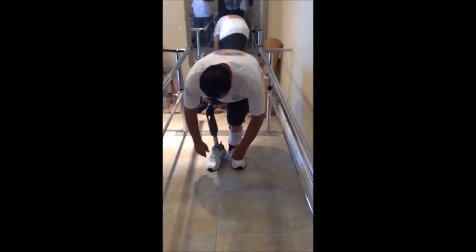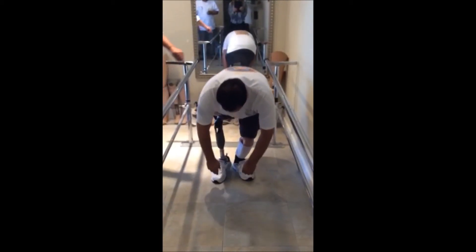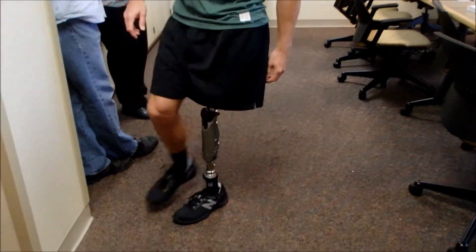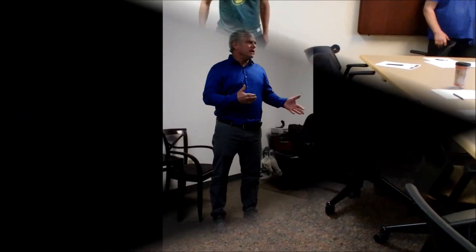Now there's no power to lift them up — that's all about the sound side and using their hip — but they can do range of motion they've never been able to do before. All of that translates into those periodic things: it's the bathroom, it's the kitchen where people fall most often. So they're able to push backwards in a bathroom or kitchen and make strange motions, and those motions are where they fall. I like to train them with that, and once they get started with that training, they're very much free to do a lot of different things.